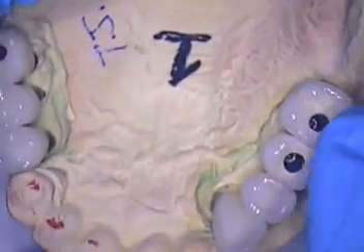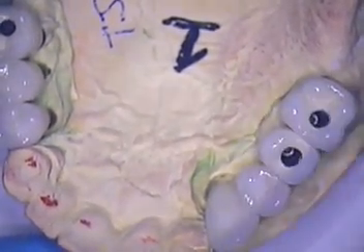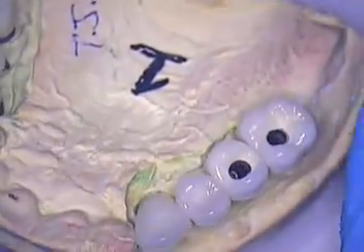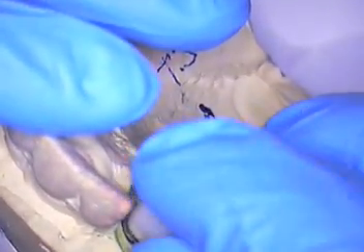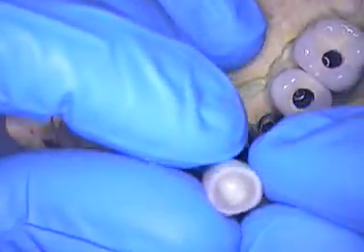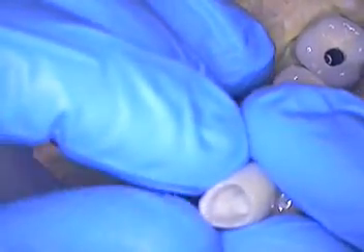Once you have things checked on the model, it's pretty straightforward in the mouth. Basically you're checking occlusion, contours, your contacts, and aesthetics. These are zirconia crowns scanned from Nobel Biocare, and porcelain is baked to them — each one of those will be cemented into place.